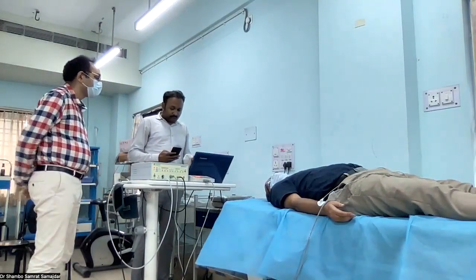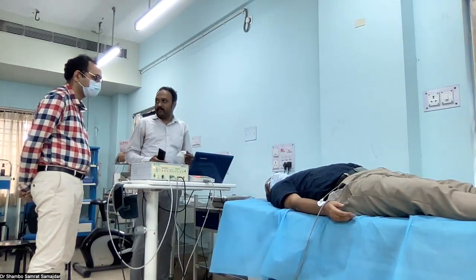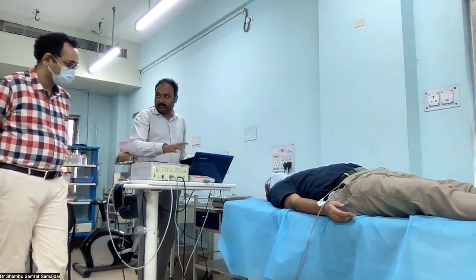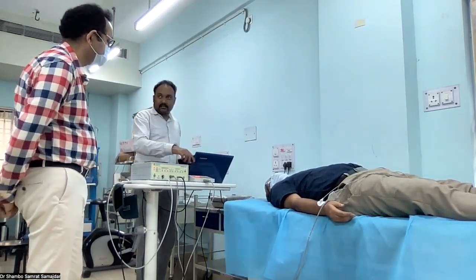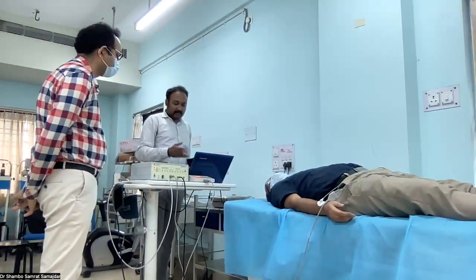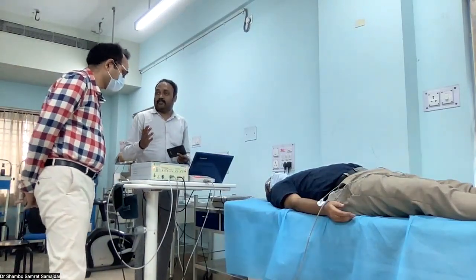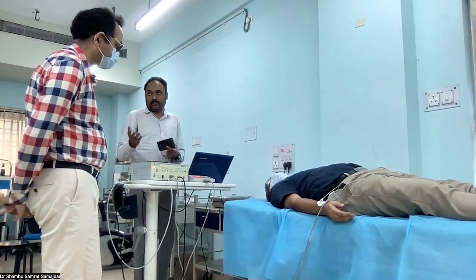Okay, now we'll ask the patient to be in supine position and we'll ask him to inhale slowly. And we have two lights set, green light and red light. The machine will dictate that. So we will ask the patient to inhale slowly till the green light gets off, and exhale slowly till the red light is off. It will be done alternatively for 6 times. And meanwhile, we will also record the ECG while taking deep breathing, inhalation, and also breathing exhalation.